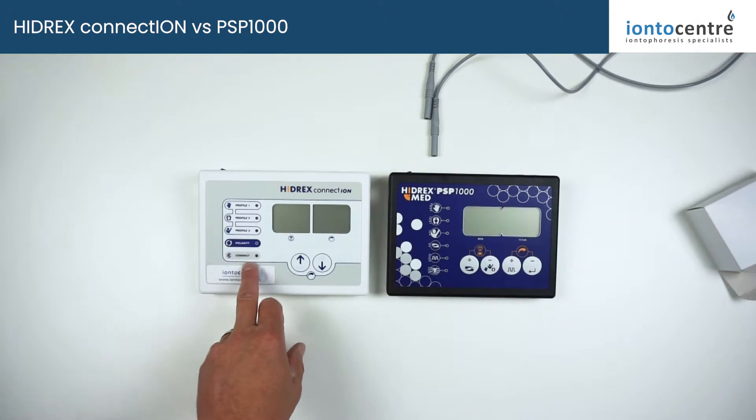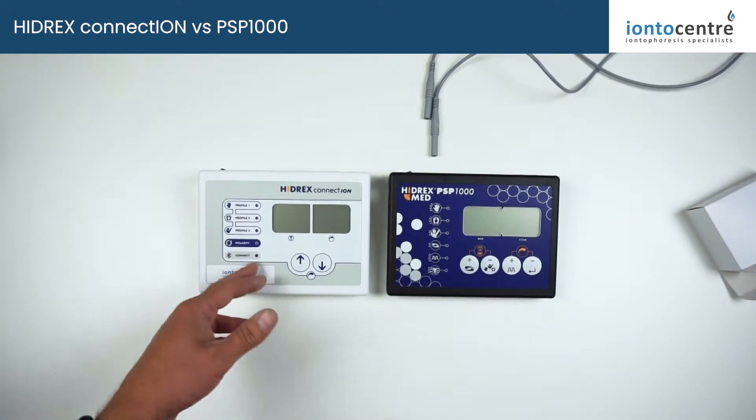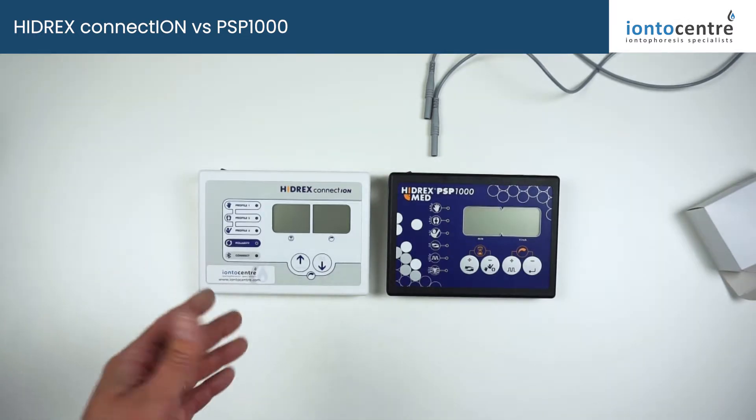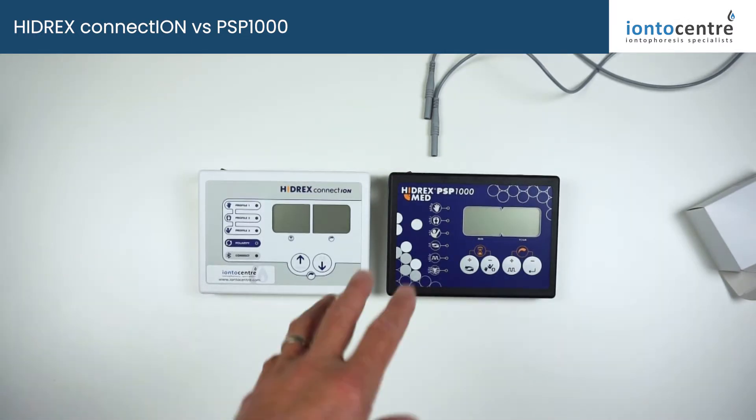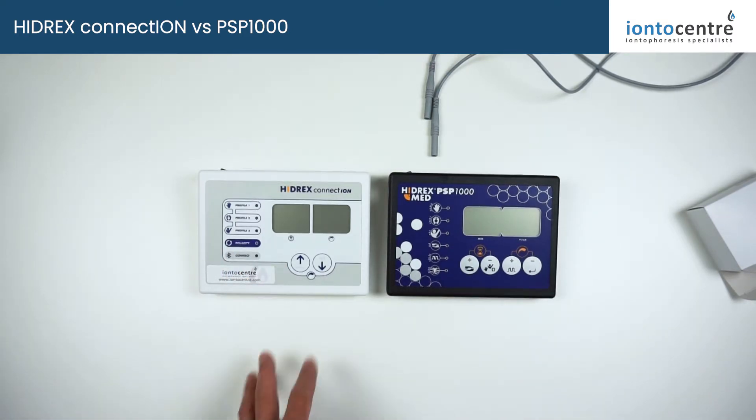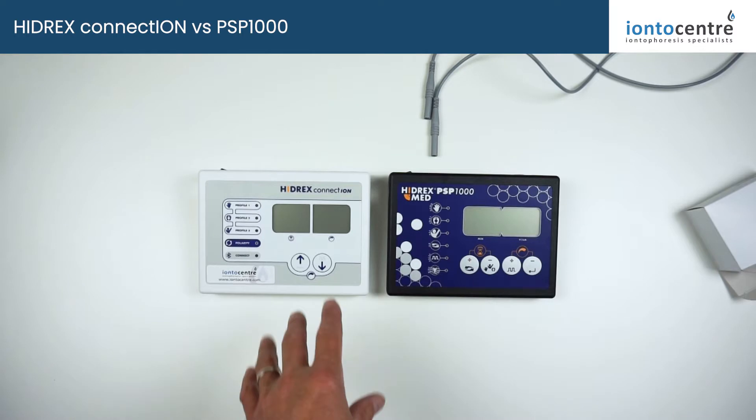It's also got Bluetooth connectivity which, via the Hydrex app, opens up a whole new host of features. We can dial in and give support, you can do voice activated control, and lots of different features from the app — but we'll talk about that in a separate video because it's a little bit more complicated than the basic operation.